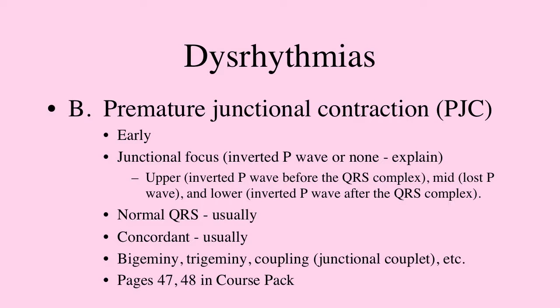Those are kind of in the category of PACs, where they're usually not a problem. Unless you have a lot of them, a few PJCs are generally, again, innocuous.